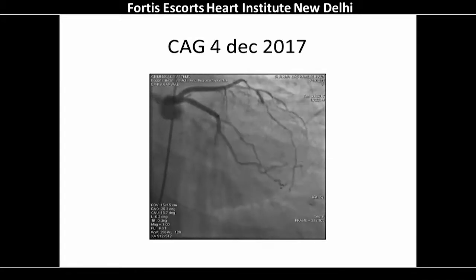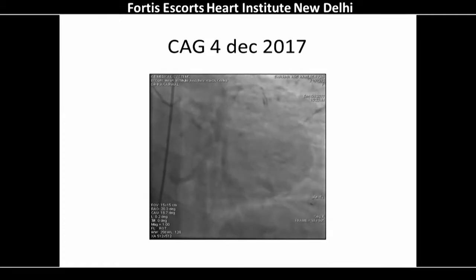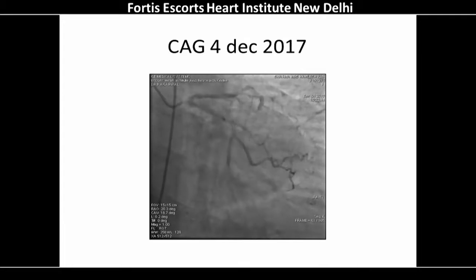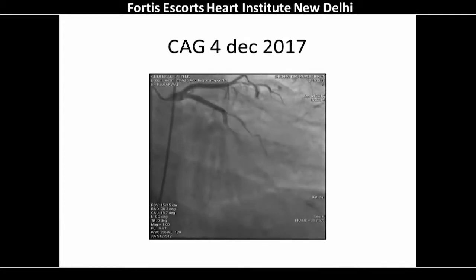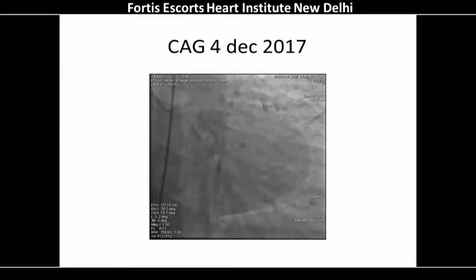Okay. So what was done? Now let us see, we are now live. Whatever you say, we'll do that. Can you show the angiogram, the first angiogram? We have not seen the right. We are just treating this lesion right now. Right is exactly the same.